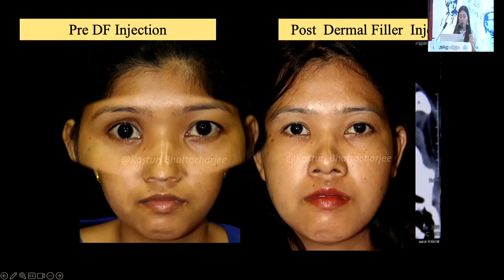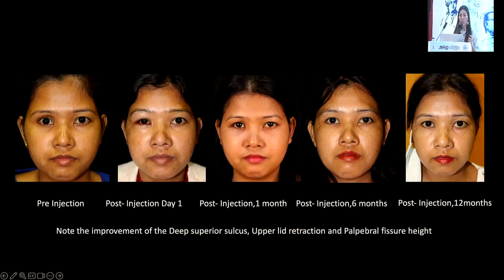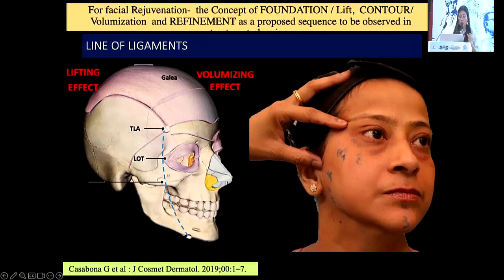This is how she came to us. And we looked to her superior sulcus deformity. And it is much better following the injection dermal filler. But this should be done as a very advanced procedure. And please not for the beginner.